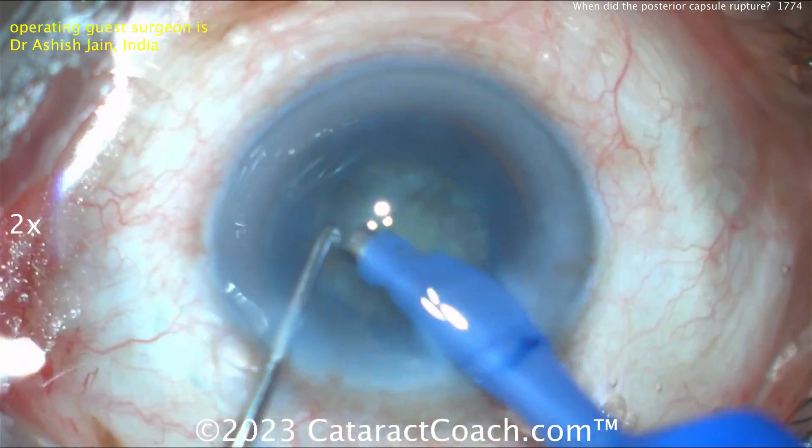Buzzing again, another chop into quadrants for that first half — very skilled surgeon, beautiful chop technique. Another set of quadrants and now you've got four quadrants, all you've got to do is remove them. Routine case — bring that first piece up, a little sub-chop if you want, rotate it if you need to, get that piece up nice and easy.